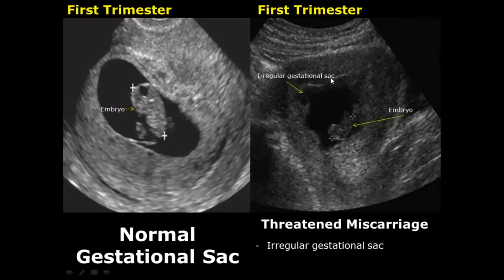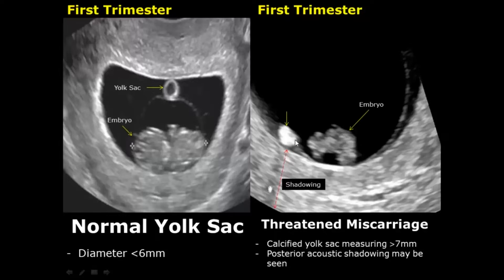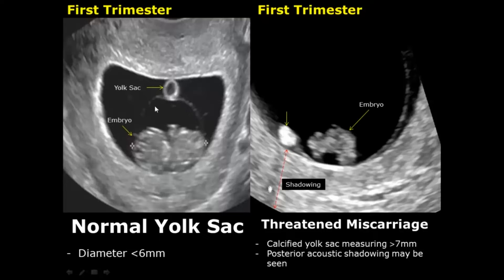The next feature is an irregular gestational sac — in the normal case the gestational sac is very smooth, but in this case the inner walls are irregular. The next feature is a calcified yolk sac that measures greater than 7 millimeters. A normal yolk sac is circular with an anechoic or hypoechoic center and a hyperechoic rim, and the diameter is usually less than 6 millimeters. The calcified yolk sac is hyperechoic and may have posterior shadowing.